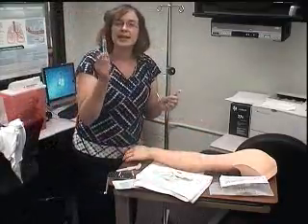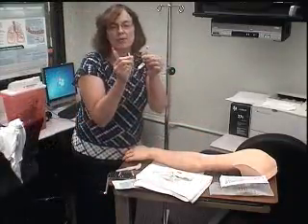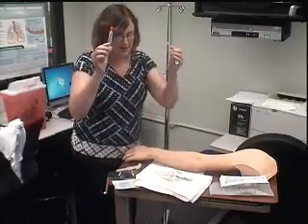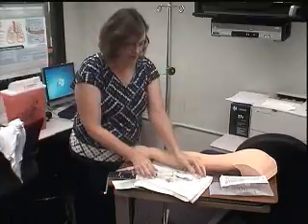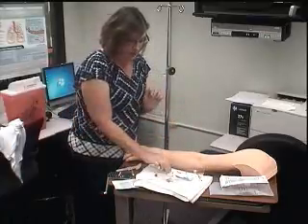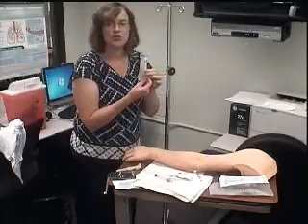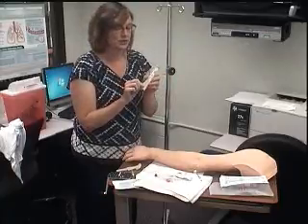I'm going to get a saline flush. This of course would come in a package, it's brand new, and this comes in a package too, and it's sterile. Okay, so I have this in a package, sterile, brand new. I'm going to get my IV catheter. I chose a 20 gauge, so that's what I'm going to bring into the room.